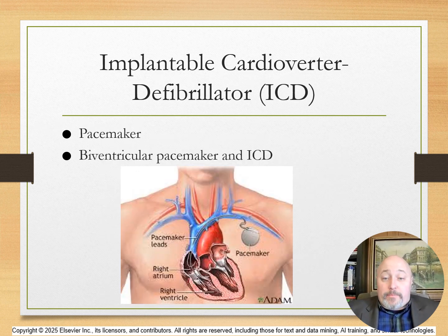In the case of the implantable cardioverter defibrillators, these have an additional electrode wire placed through the coronary sinus into the left ventricle. These additional pacing wires are in the atria and the ventricle, pacing both ventricles simultaneously, improving heart function in a certain number of heart failure patients. Synchronous depolarization of both ventricles improves cardiac output as well as ejection fraction.